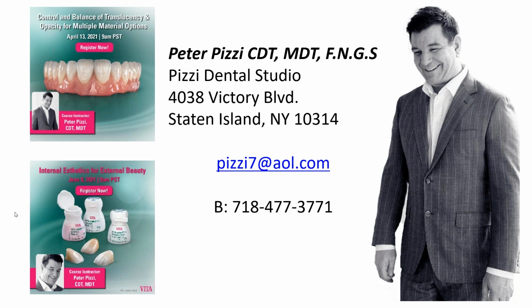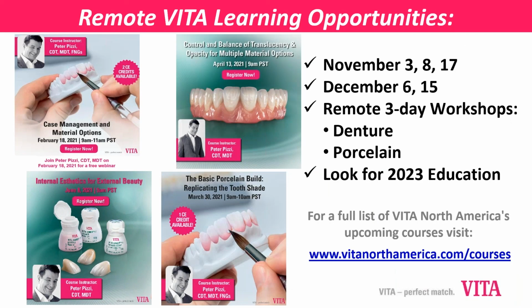And the reason I never do is because if I'm matching an A4 tooth with a lot of dark staining, well, I'm using that A4 or that 5M2, and then the coloration that I'm using is usually in the brown or orange or mixed family, right? So once you're in that world, I don't know if I need to really measure the staining itself. Although if you wanted to, I would say then you go right to the stain. So every staining system has a shade guide with it, right? And you can actually see all the colorations that are there.